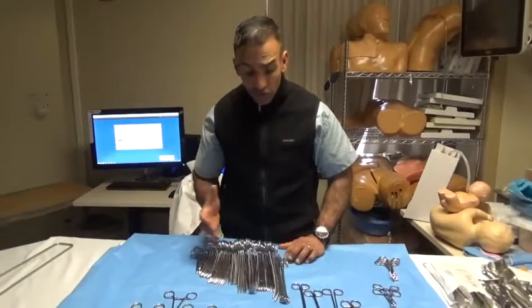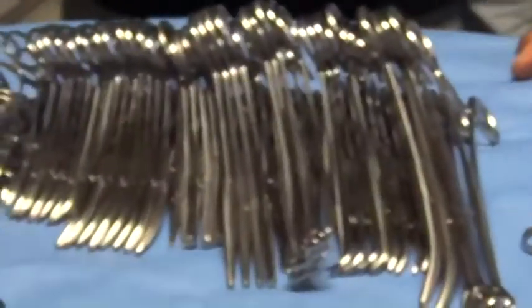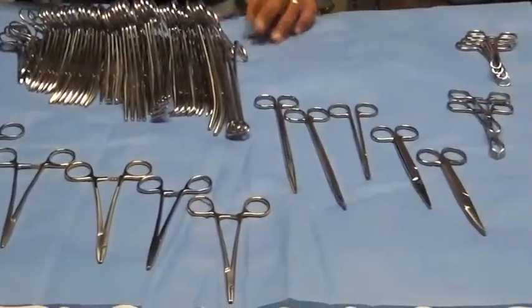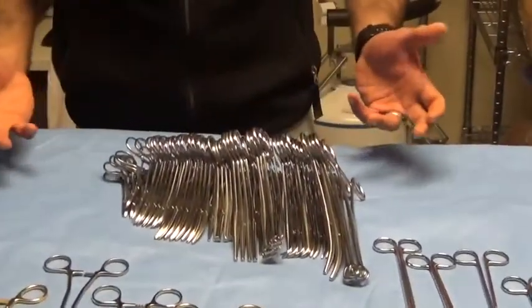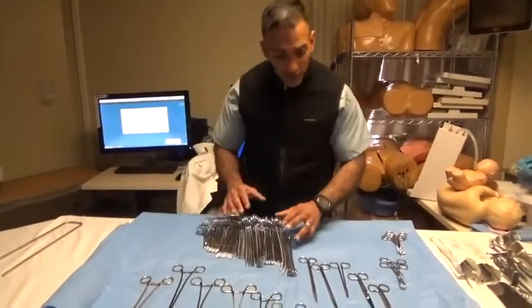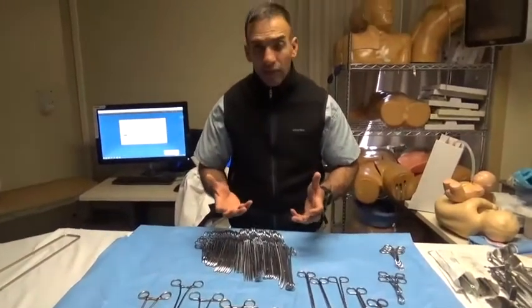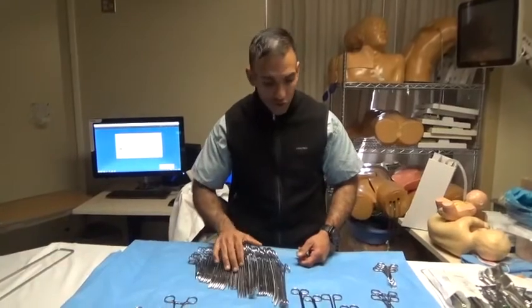You walk into the operating room and you see this intimidating rack of instruments that look like a bunch of scissor handles. The first time I was in an operating room I was actually very young — my father's an anesthesiologist, so I got to shadow him. I looked at the back table and there was just a bunch of scissors. Well, they're not all scissors; they are designed with scissor-style handles to maximize the mechanical use of our hands for executing instrument movements.